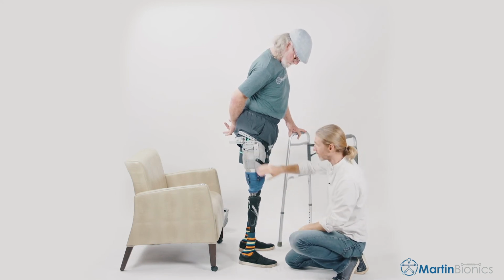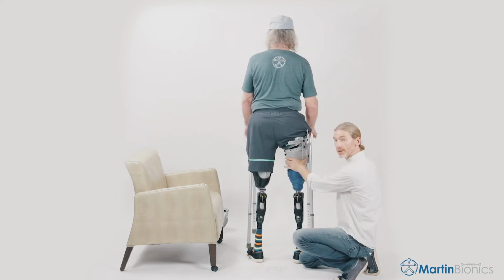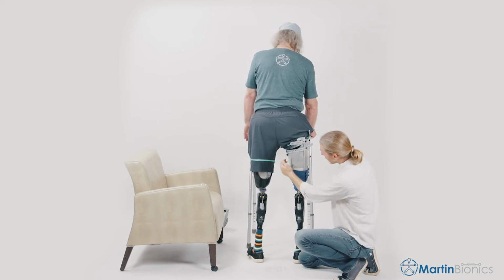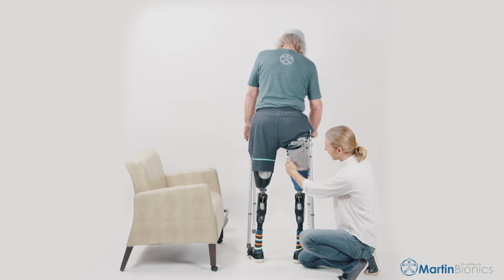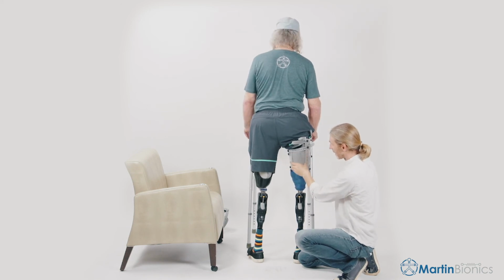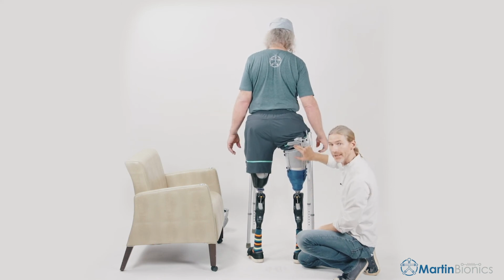They're well contoured to the limb shape. Can you face that way for me, Tom? The posterior side of this should frame the muscle belly, the hamstring muscle belly. So the posterior medial strut is sitting right under the tuberosity, running straight down the limb shape, making the hamstrings look due posterior. Now, we want to make sure that our proximal webbing is nice and snug.